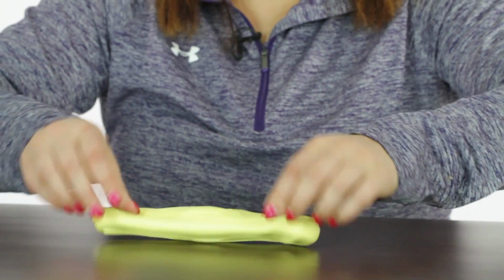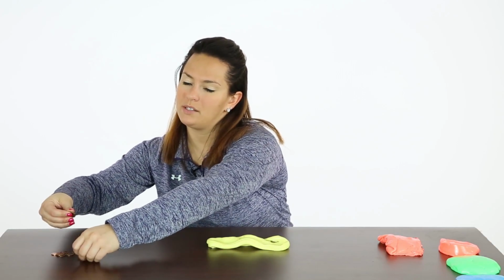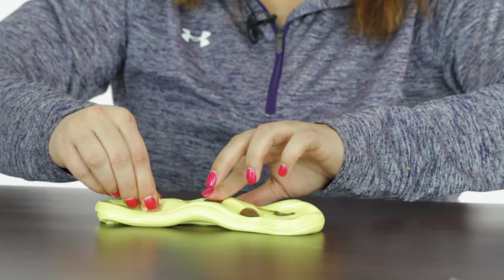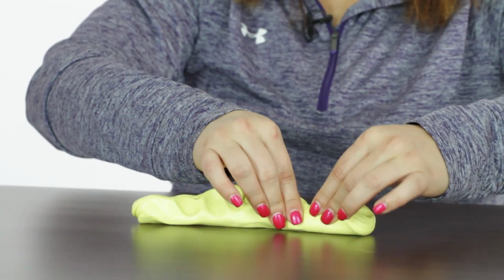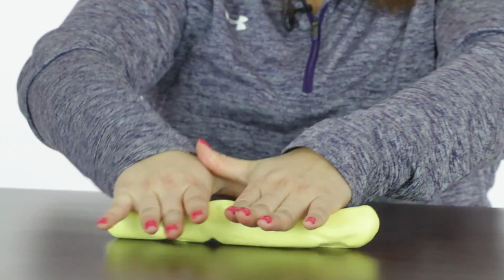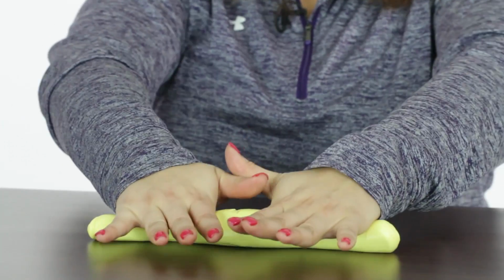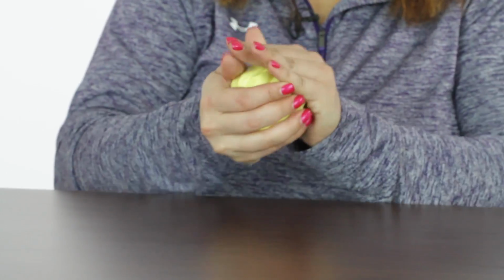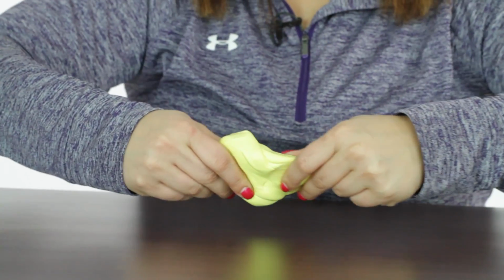One activity we're going to try is we're going to hide some pennies. If you have pennies or buttons at home, this is an easy thing to push and hide in putty. Kind of make it a game. You can pinch them closed, roll it back and forth, smash it into a ball, and then we're going to dig the pennies out.